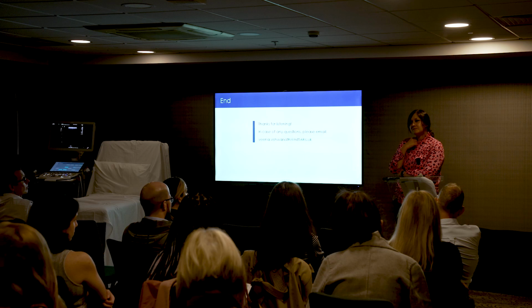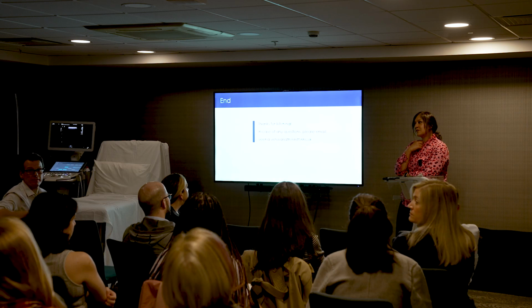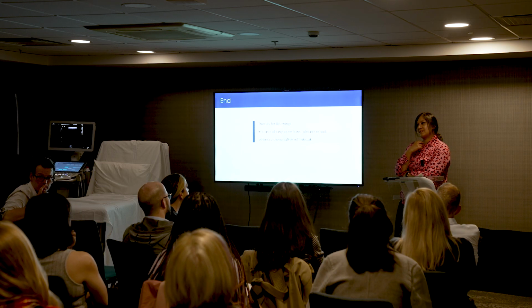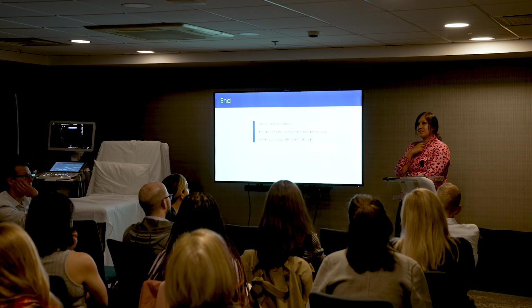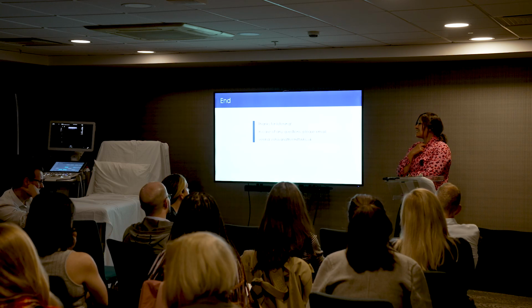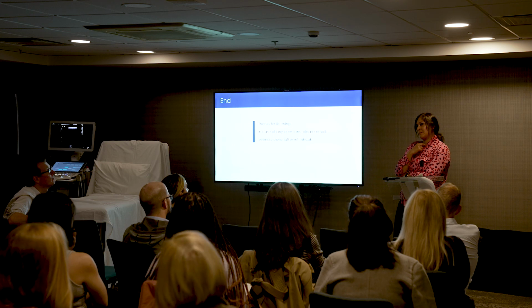What's the smallest nodule you would have a go at via FNA? So probably 4 millimeters is the smallest that I've done, because we widely use the U classification at MFT, and I would definitely have a go. It may not come back adequate, but I'd say anything below that would be tricky, but it is worth a try, really.